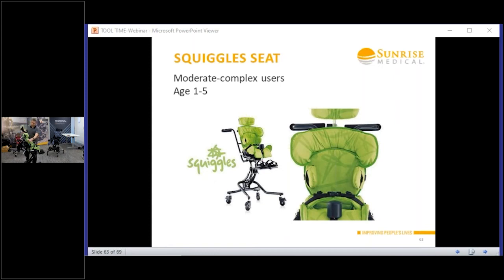So you've got that shoulder protraction. This is obviously to make the chair grow taller as they have those growth spurts, so you can actually get a bit more life out of the chair. If not, you take this whole section off and then it becomes even smaller sizes.